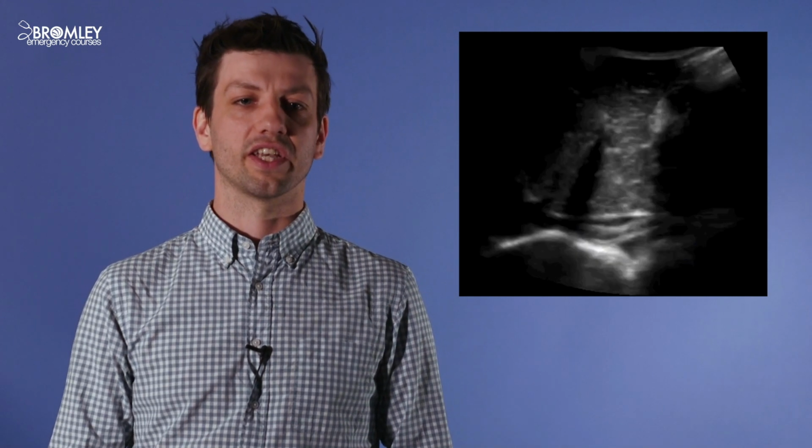And here again we see a very big plethoric IVC, and we also see a distended hepatic vein. That's the vessel that's at the top of the screen running down into the IVC. So we've seen a few examples of very plethoric, large IVCs, and here we see 2 examples of very flat IVCs, where during inspiration the walls of the IVC are kissing, they're meeting, and that suggests that this patient has a very low preload or is likely to be hypovolemic.